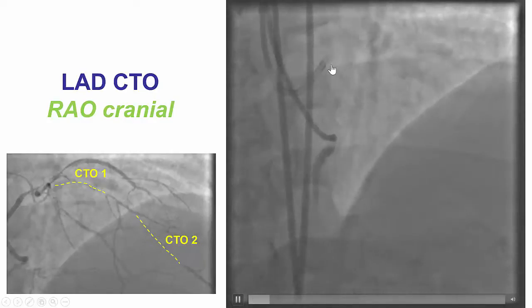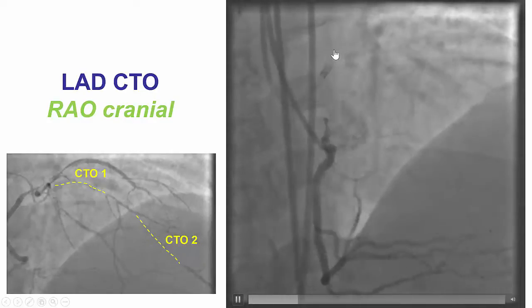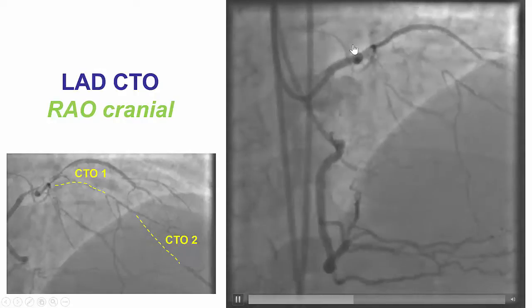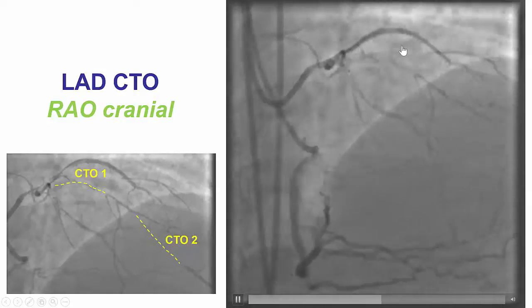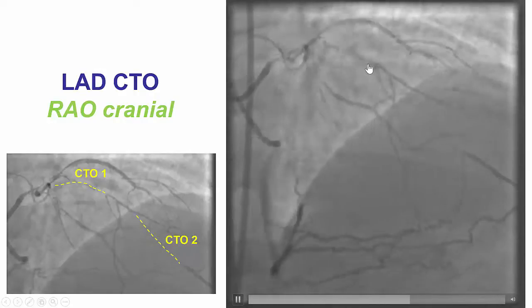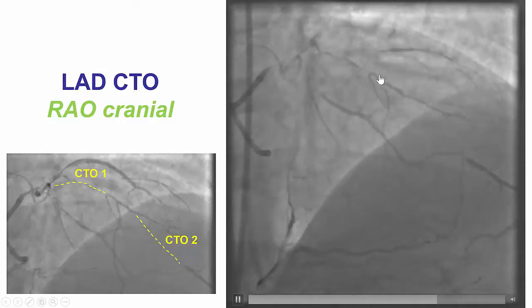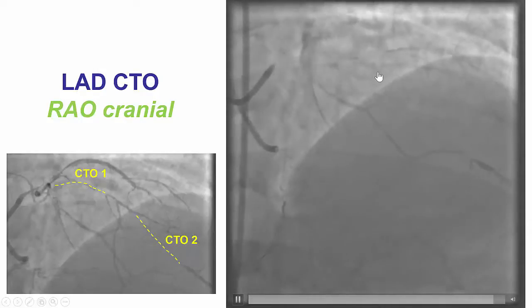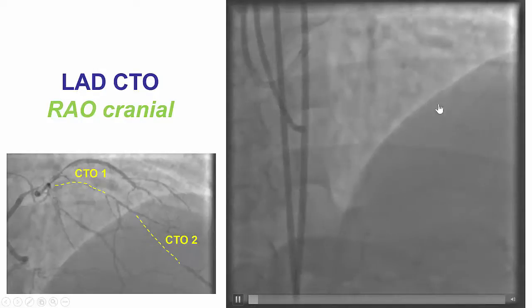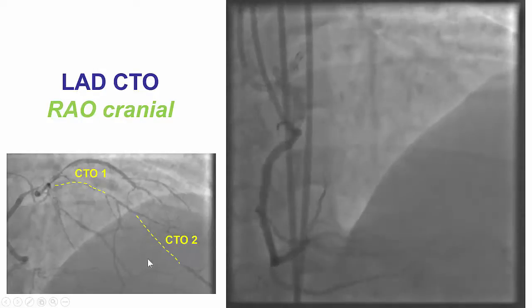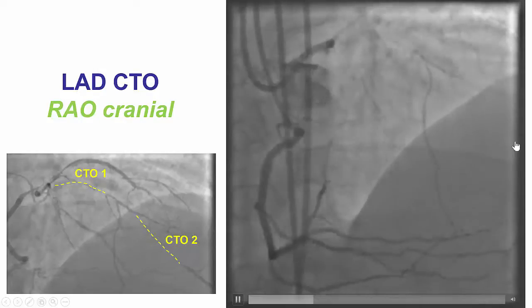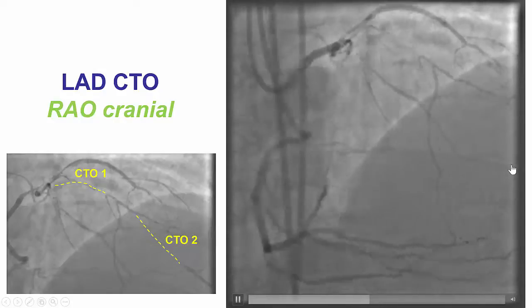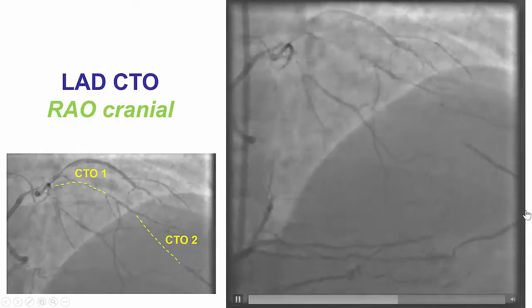There was a CTO of the ostium of the LAD immediately proximal to a previously placed stent, then there was some filling of the mid-LAD via collaterals, and then a second occlusion — a second CTO — from the mid to the distal left anterior descending artery.